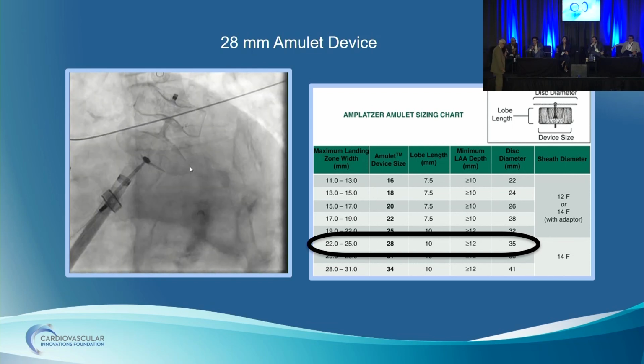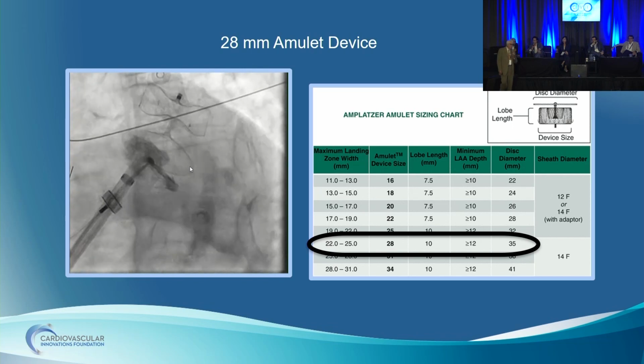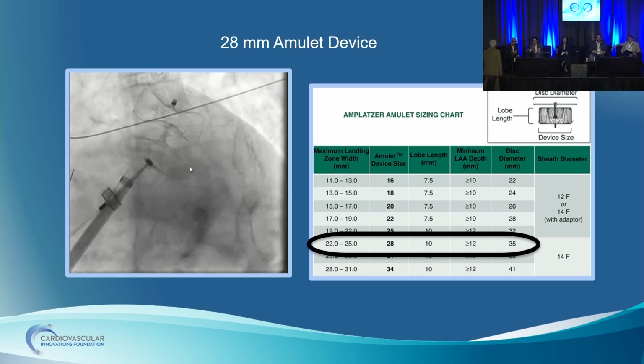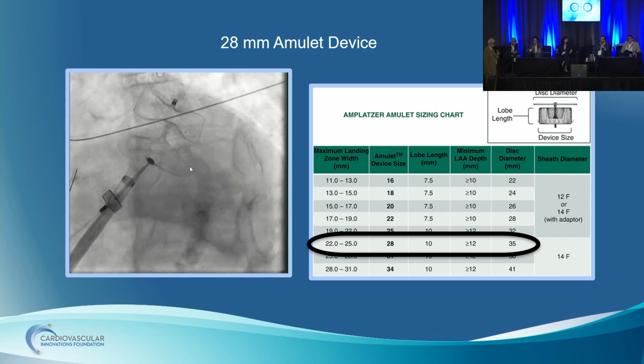Cliff, may I just add one more comment? There's the leak, but also one of the striking features to me is that the lobe of the amulet looks like it's almost fresh out of the box. It doesn't have much compression on it. That's true. The screws are very slightly offset, but I suspect that's because of the cable tension pulling the disc screw away. And that's obviously, as you know, one of the signs that there's compression. But the lobe itself just barely looks like it's compressed. So that would be another concerning feature.